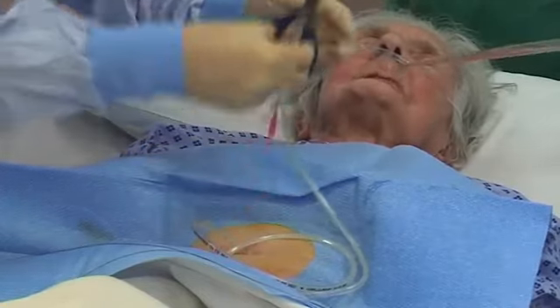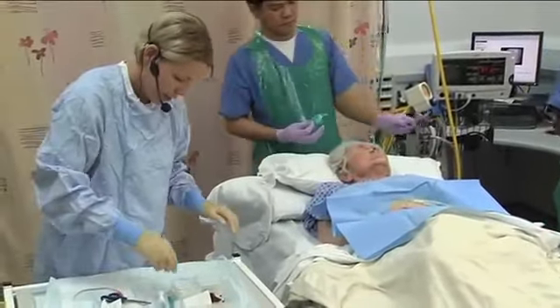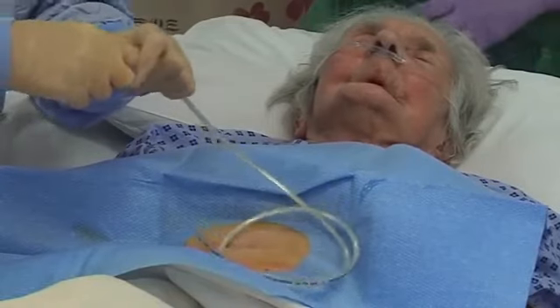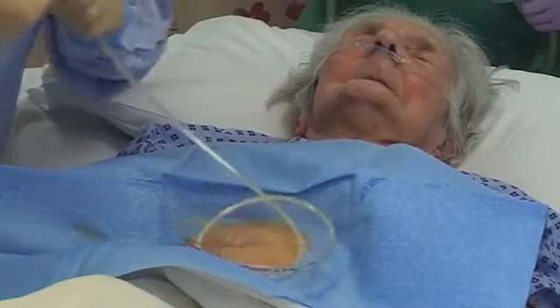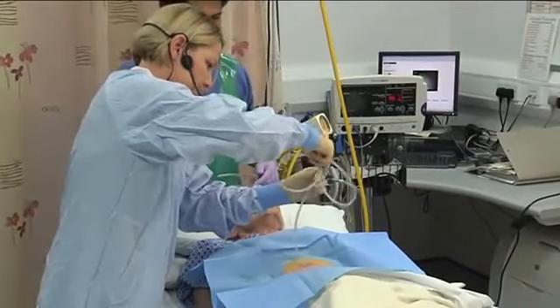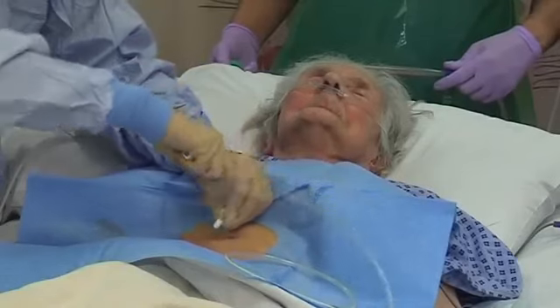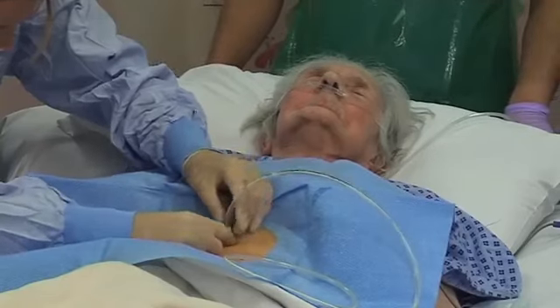so we can put the feeding connectors on, or the tube connectors on. What we don't want to do is deflate the sponge inside the tube, so we need to put the clamp on before we cut the tube itself to size. So if we just put the first bit on first with the flat bit, we have to make sure we don't put it flush with the skin. We want to leave about a centimetre gap between the skin and the connector to allow for swelling or any edema that might happen, and it can be checked again tomorrow.